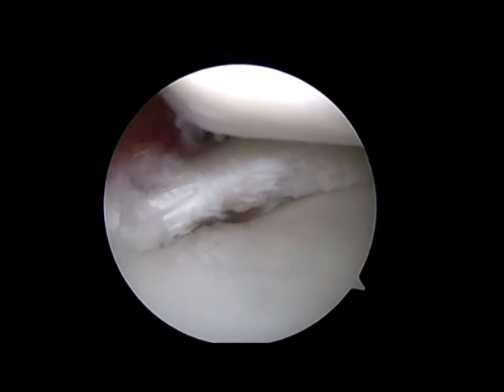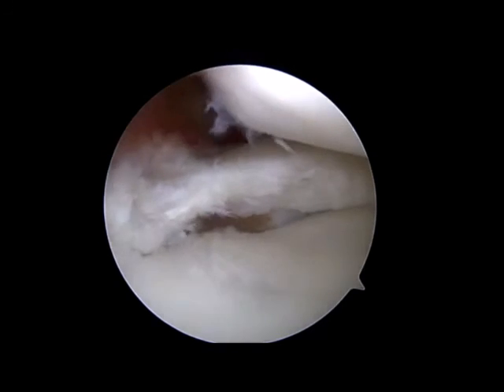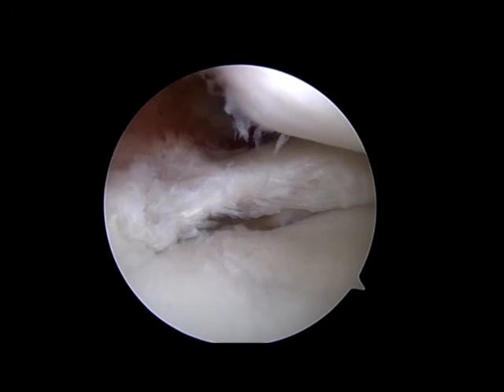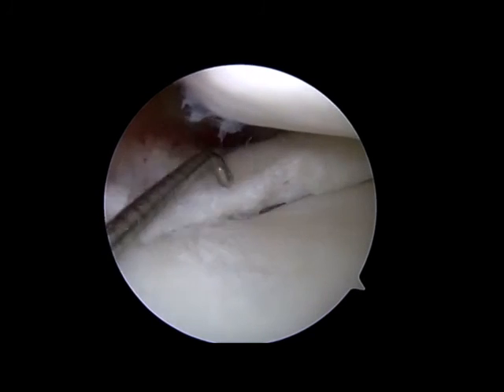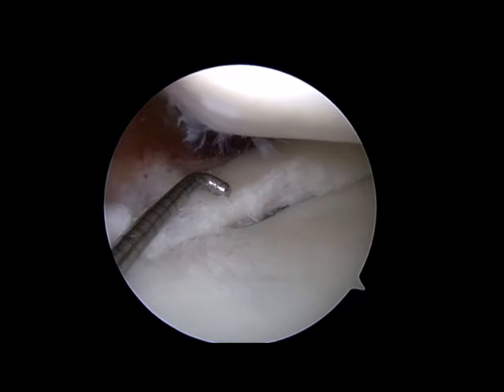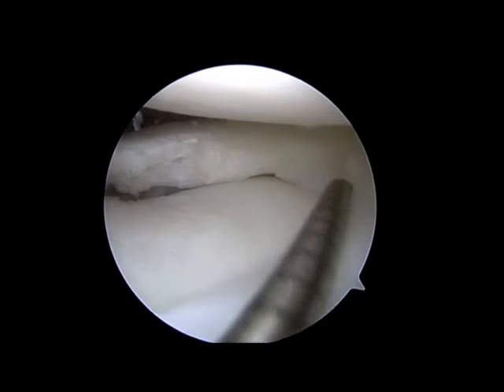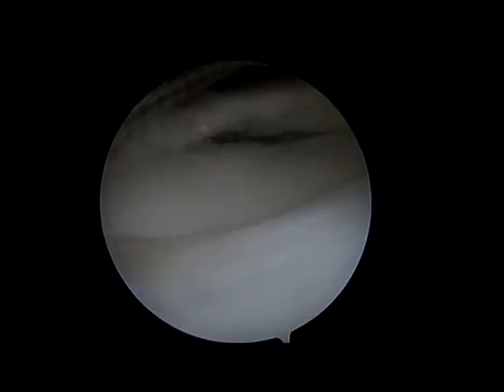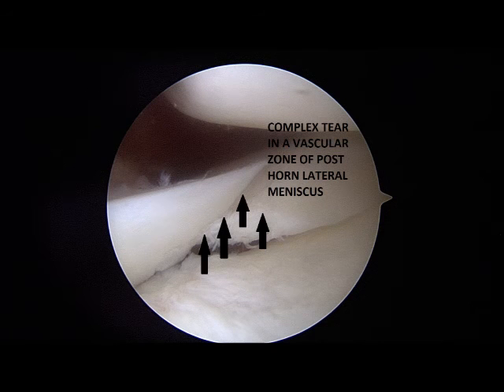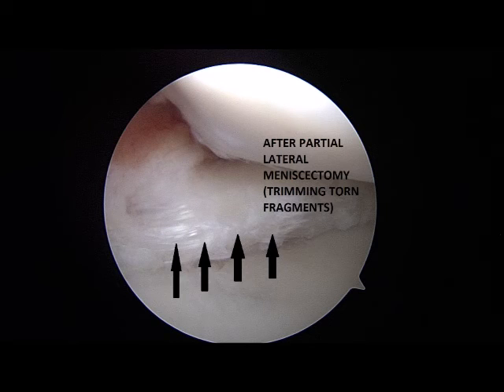There's still plenty of meniscus left. The root of the posterior horn is intact. A healthy rim of meniscus remains. The probe is brought in. I make sure that there are no more loose fragments and check the remaining meniscus. This is the before, and this is after the partial meniscectomy.